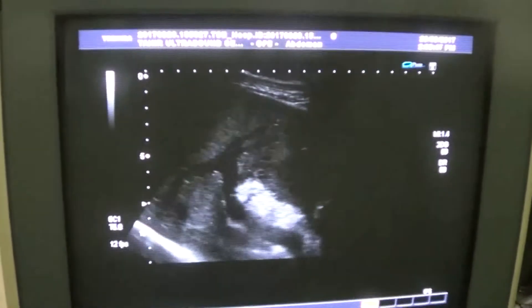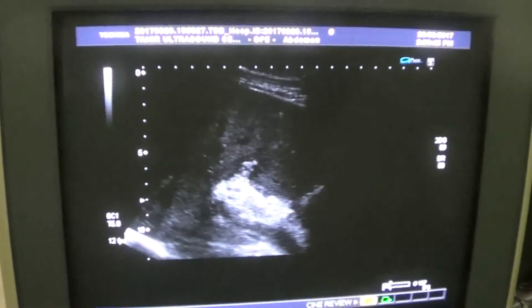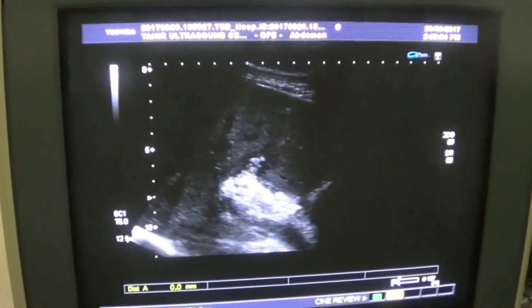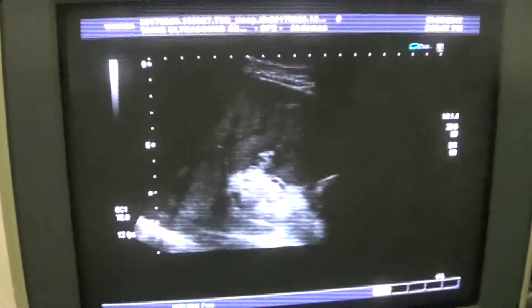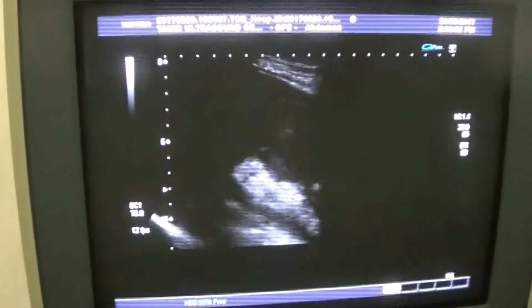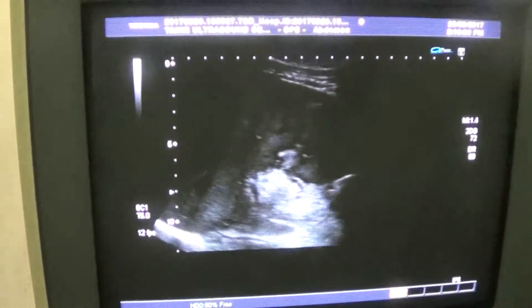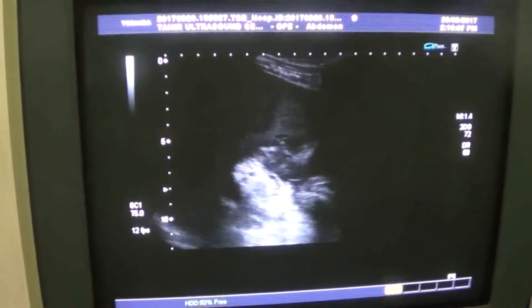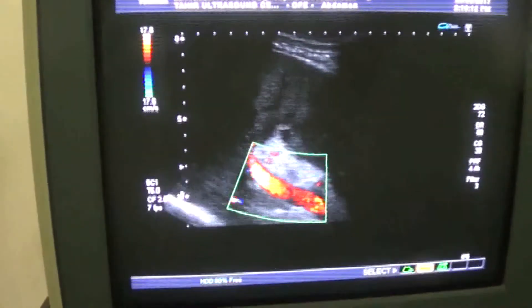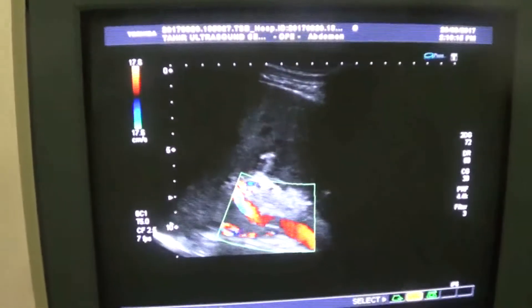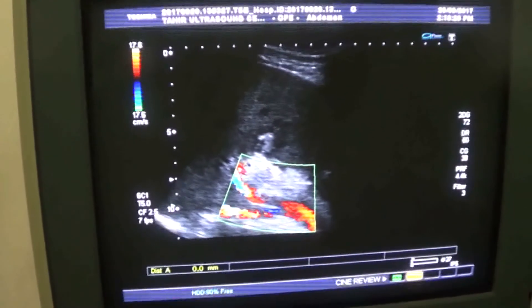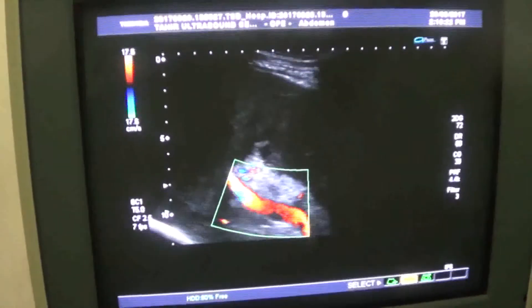In the region of the CBD, that is the region of porta hepatis, it is seen full of sludge. There is sludge and there is edema all around. You can see the thickness and echogenicity in the region of the porta hepatis. Here you can clearly see portal vein and CBD — portal vein, CBD — full of sludge in this region.